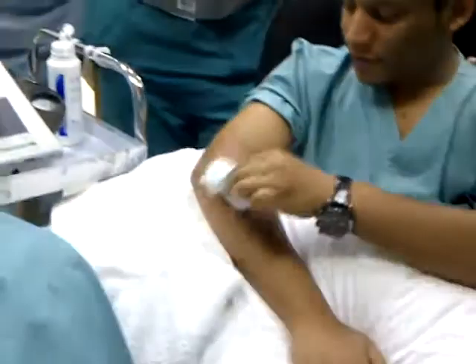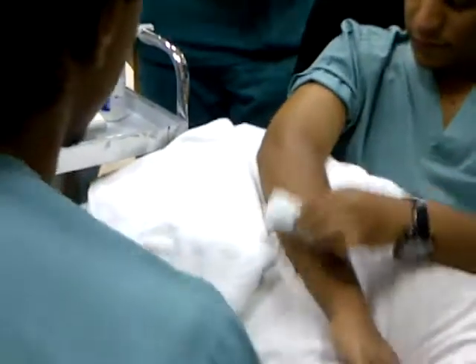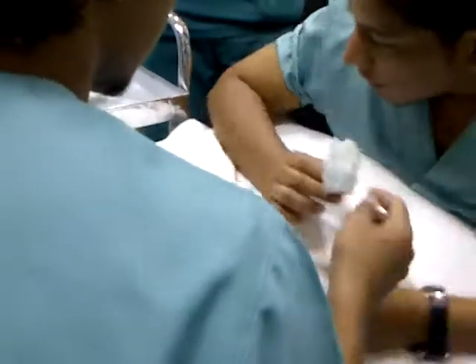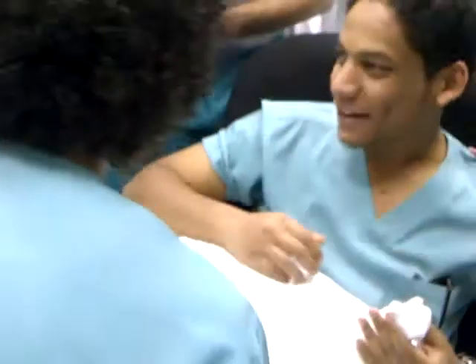The size of the head is 5 cm, but the crystal inside is less. So where is the maximum intensity concentrating? At the center. So you have to cover all the area. So that's what you are calculating.